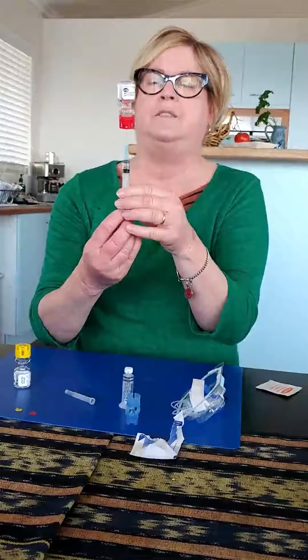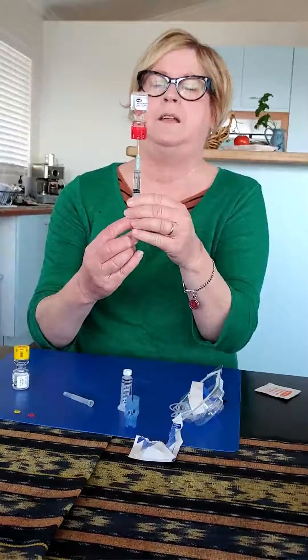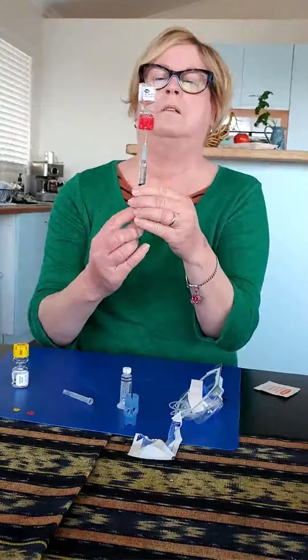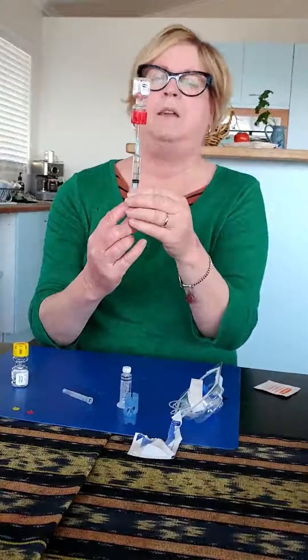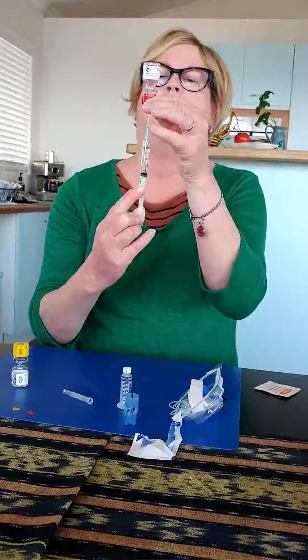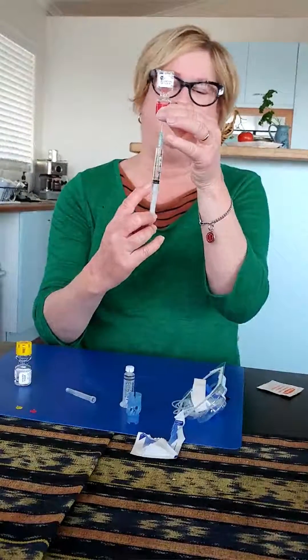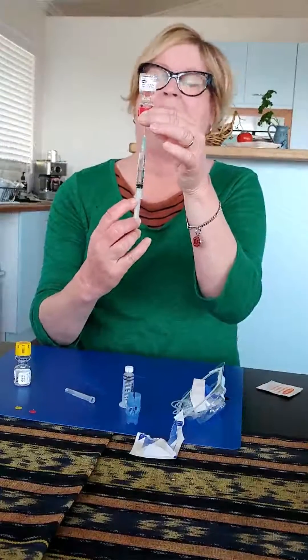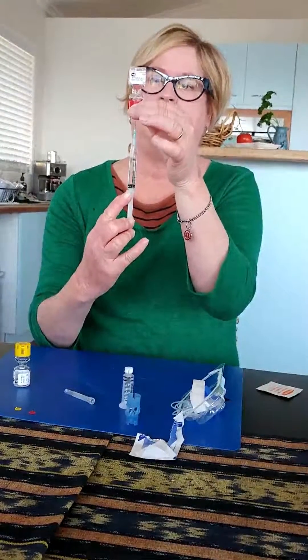Draw it down and it sort of just fills itself. Draw the whole lot down slowly. I just push the needle to the base there near the red and pull it all down. I can see that I've got it all now. Taking care, being careful not to pull it all out of the bottom — like I did once, I lost it all on the table in front of me. So I've got every last drop of that. That's empty.